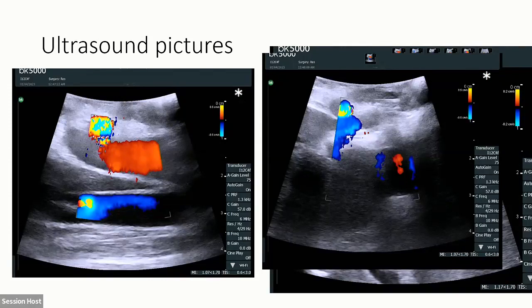They put a stent in after they took that stone out. So I love having this ultrasound picture that shows me where the stent is. Although I could see it great with the ICG, having that stent in place is super helpful when you're worried about inflammation from a gallbladder or a mass or a cancer, because I can ultrasound and just know for certain where the common bile duct is. I can see where that stent is going in place. I can see the right hepatic artery, which is coming behind the stent in this location. So I know in my dissection exactly where I am.